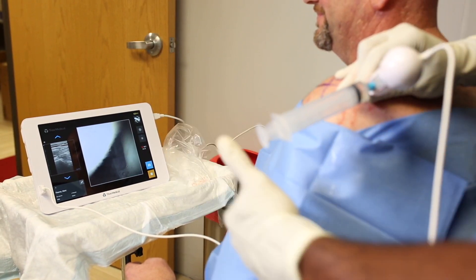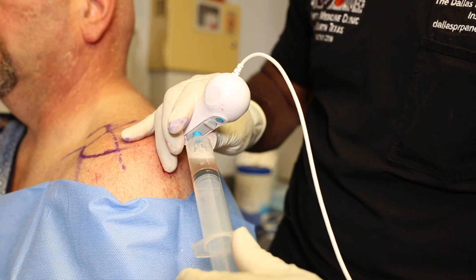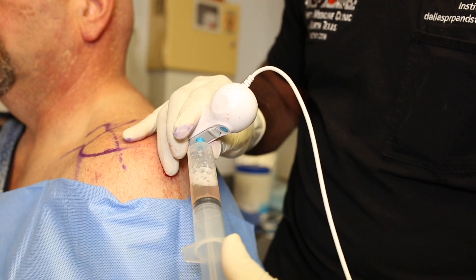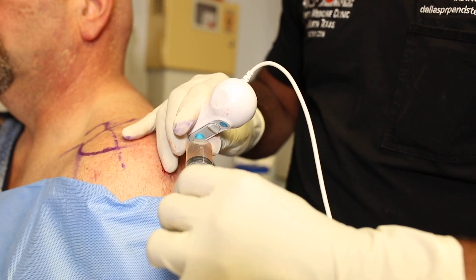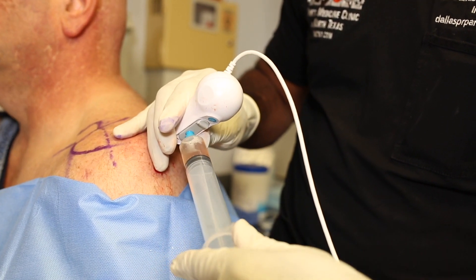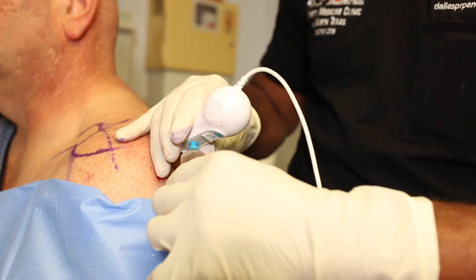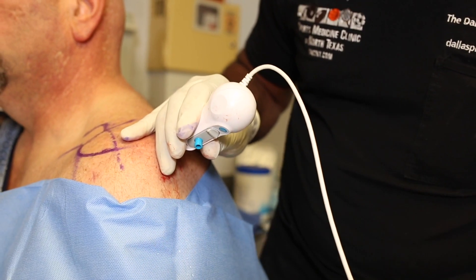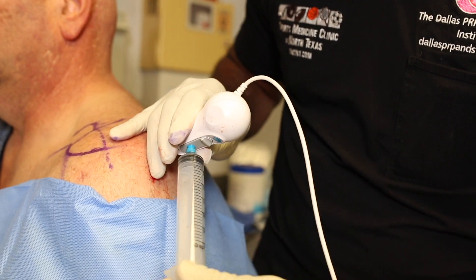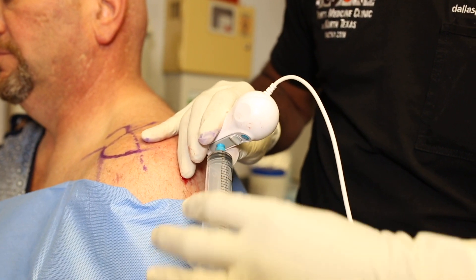Alternatively, if the goal is to use an orthobiologic, at the end of the procedure we can put a different syringe on the luer lock and inject into the joint. Whether you aspirate out normal saline or inject an orthobiologic — or both — what determines what happens at the very end is the clinical decision made with the patient. If we've decided to use an orthobiologic, such as PRP or bone marrow concentrate, we would inject that now to treat the patient's degenerative joint disease.